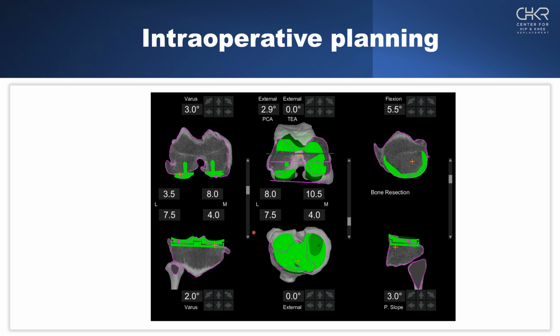Okay, and then on the tibial side, I know the composite thickness is about 9mm. The lateral side is always higher on a varus knee, and so I'll set it at 7.5 with a neutral rotation and a 3-degree slope for a cruciate substituting design.